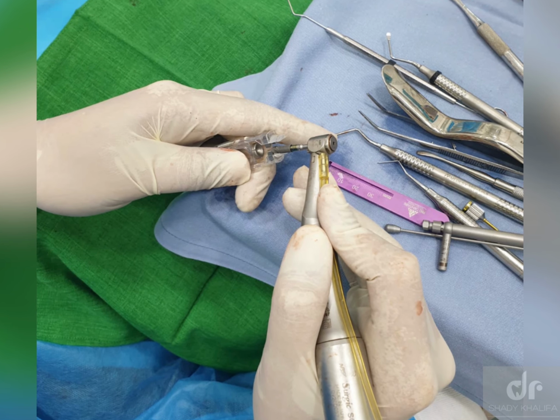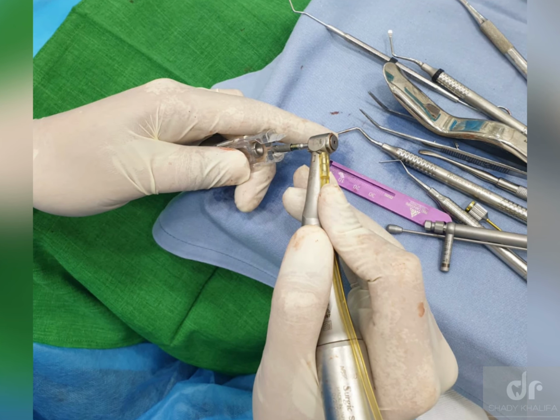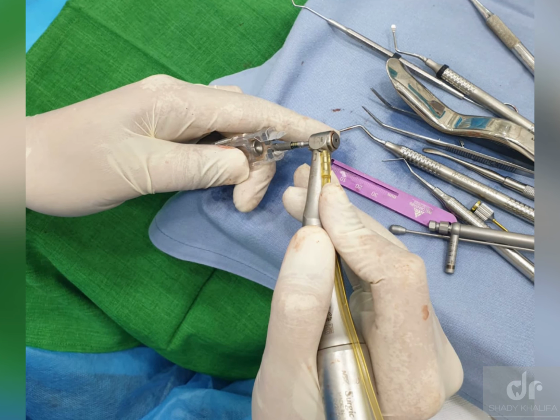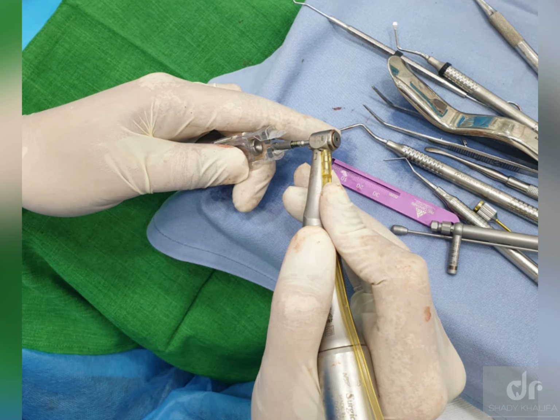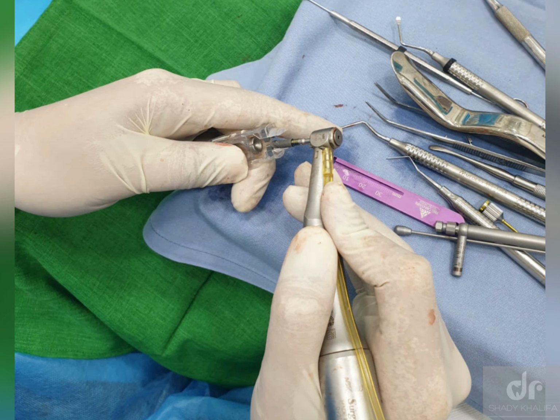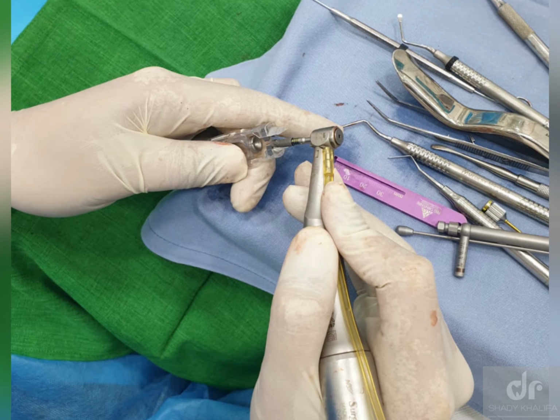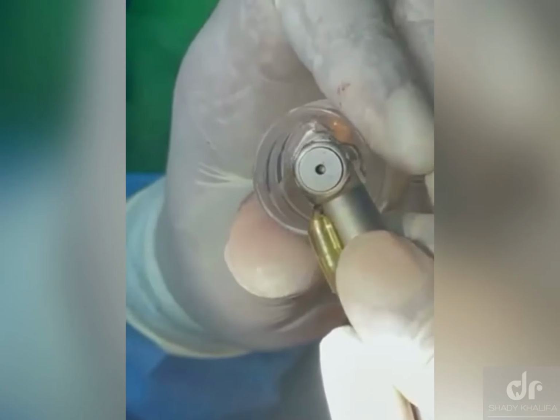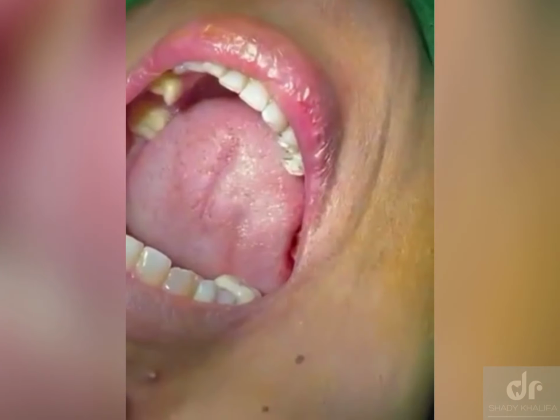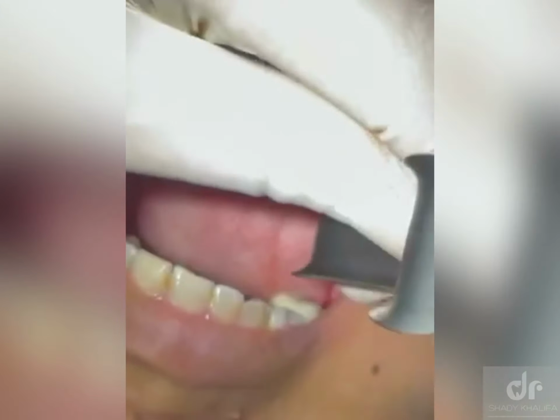After that, we will put the implant. It's very important to fix the implant in the handpiece when you start, so it will not fall down. Make sure that it's fixed to the handpiece. Do not contaminate the implant with any instruments or tissues.